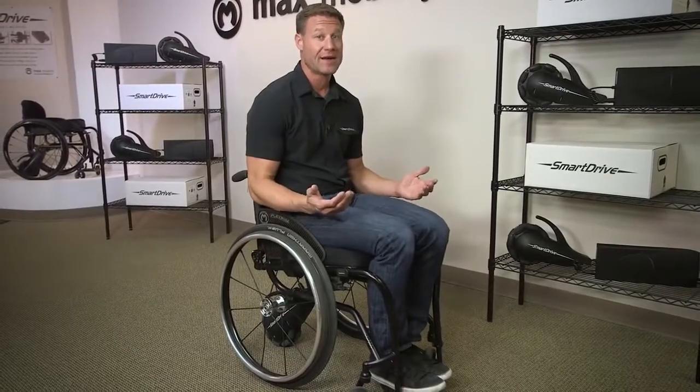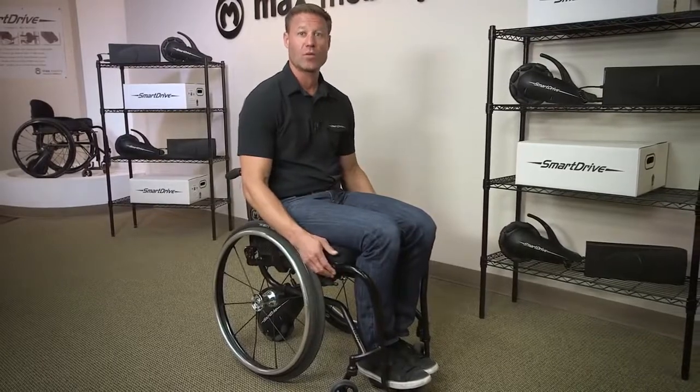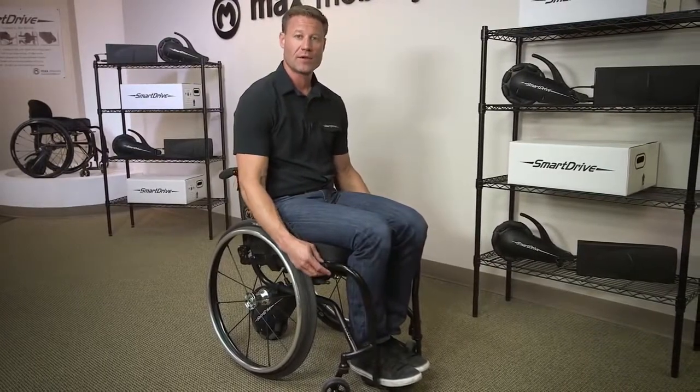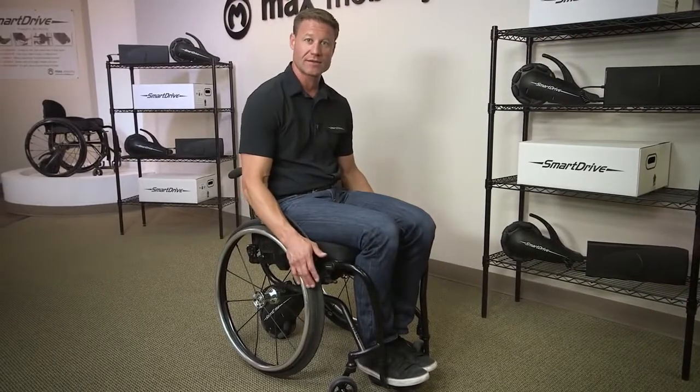It's very important that you can see the lights. If your cushion hangs over them and blocks the light, you may need to get a different cushion. It's also very important that you can easily access the buttons while you're using your chair. The button straps can pass underneath the seat rail to get them as close as possible to your hands.